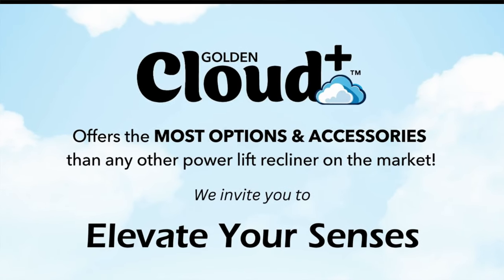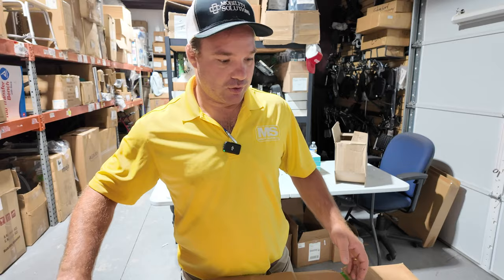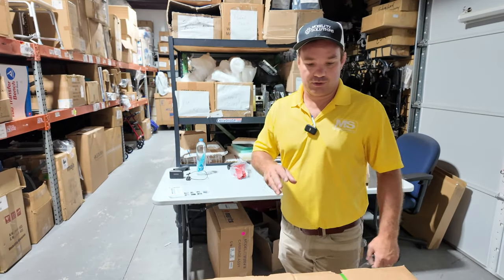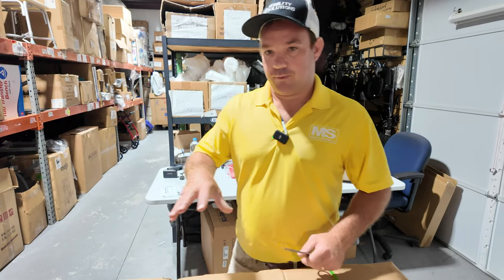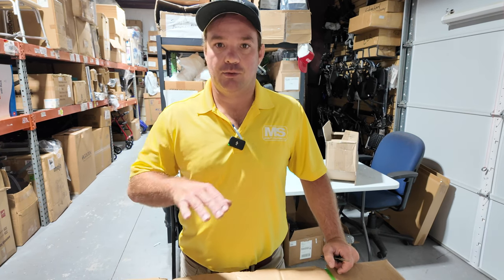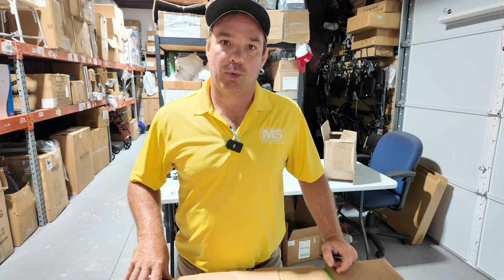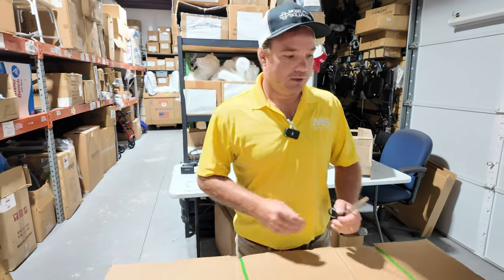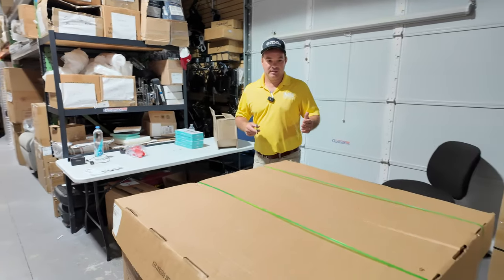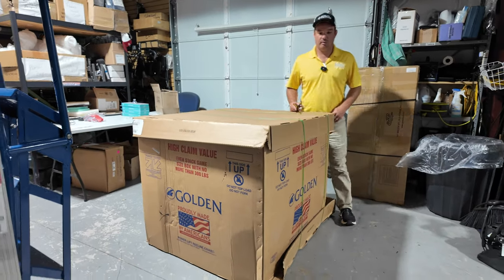The Power Cloud Plus from Golden Technologies has a lot of cool accessories you can add to it, like storage compartments. When you order this chair, there are three ways of ordering it: free curbside drop ship, threshold delivery if you have a zero threshold or garage, or a premium white glove delivery. The fastest shipping time is going to be the free drop ship curbside.